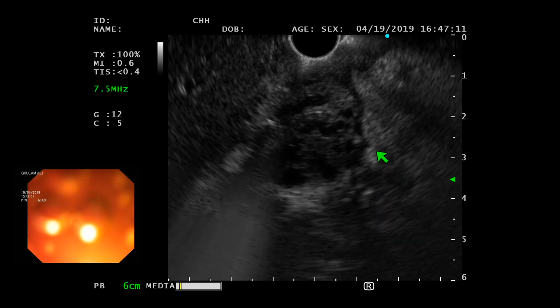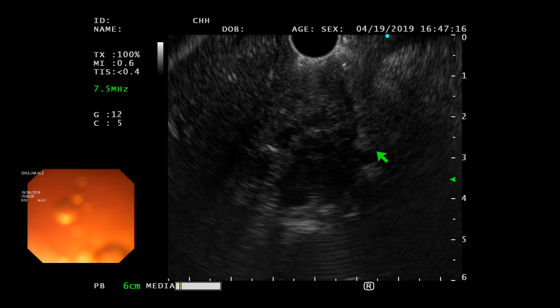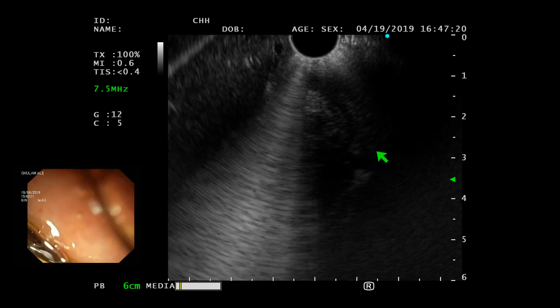Because when there is that much inflammation and collaterals, that changes the anatomy to some extent. Then you have to go with your landmarks. Do I need to pull it back further?